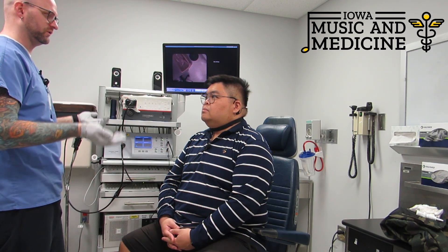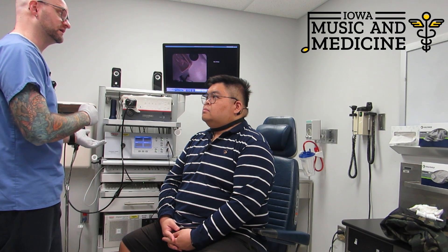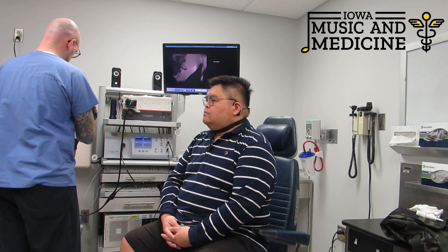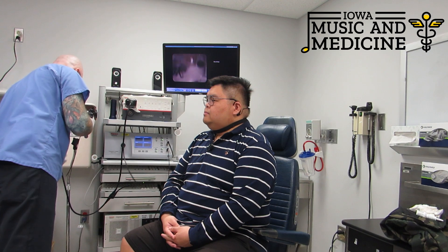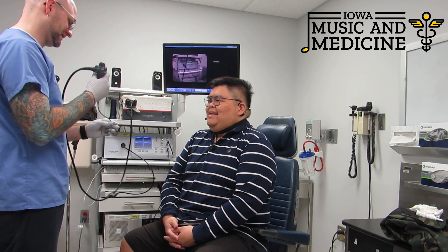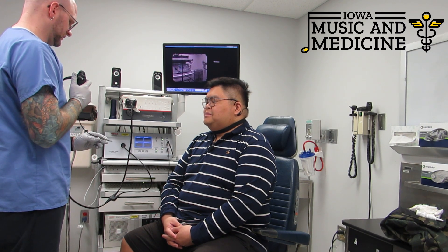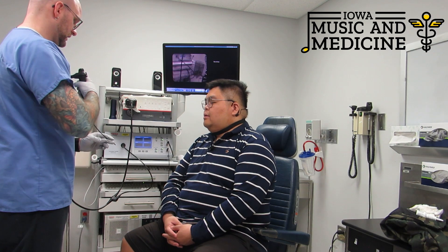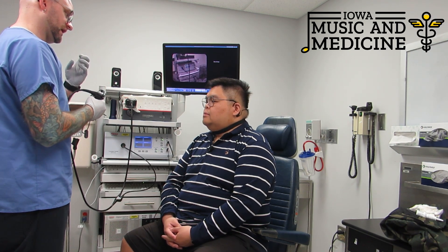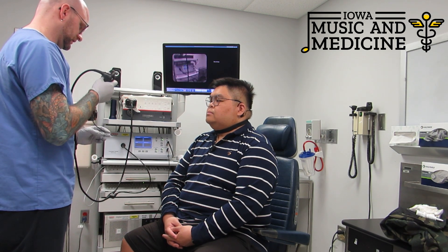So if your vocal folds are vibrating at 150 times a second, the light will flash at 149 times a second and set up that slow motion vibration. So this is the flexible camera — I call it my coupe spaghetti camera. You can sort of bend and twist with this toggle on the top part of the camera here. I can steer it up and down and then move it side to side as we're going through the natural tunnels inside your nose that have been opened up a little bit by the afrin that you instilled before you came into the clinic room.